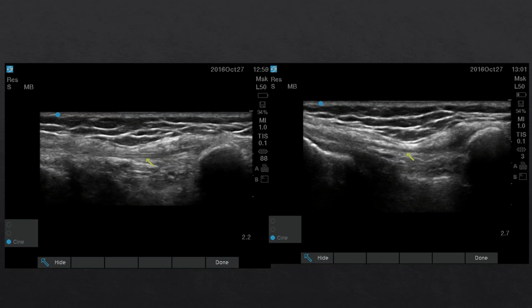On the right, you will see there's a slack in the tendon, oh sorry, ligament, the LCL. So on the right side of the image, you have the LCL, which appears hypoechoic, especially where it's attaching to the fibula. But you will also notice that there's a little slack in the ligament, and that's why it appears hypoechoic here.